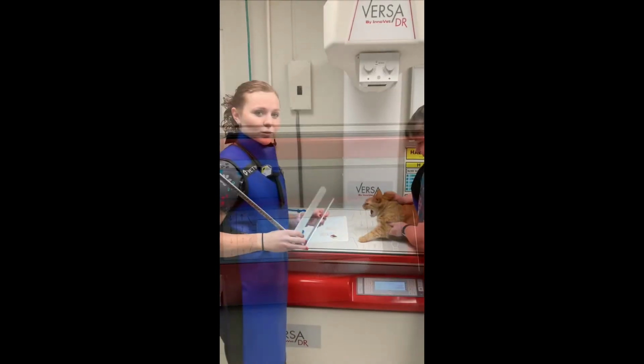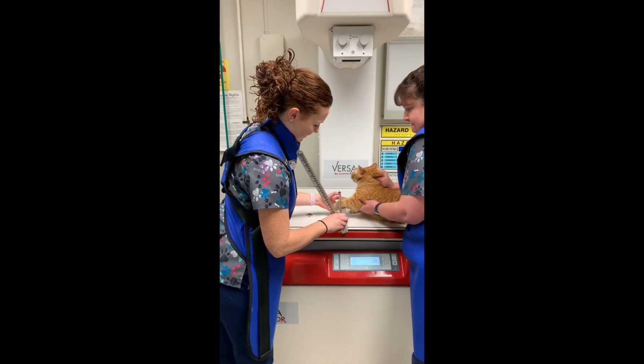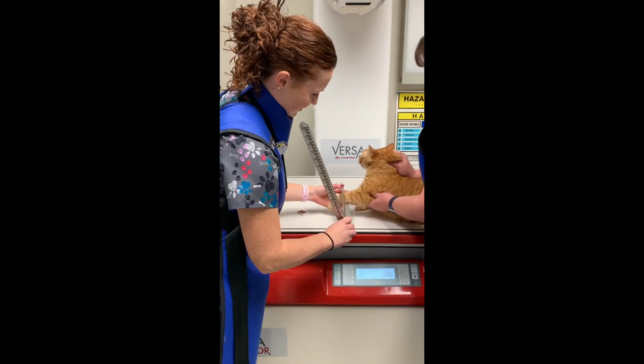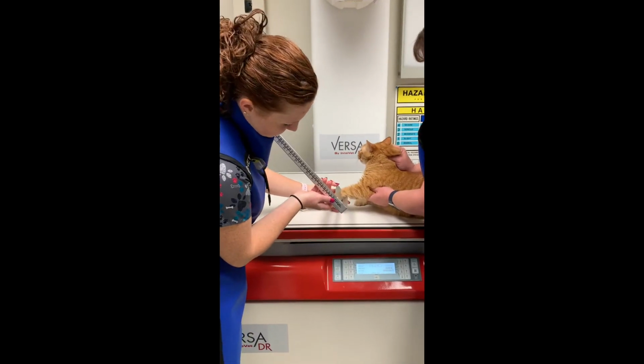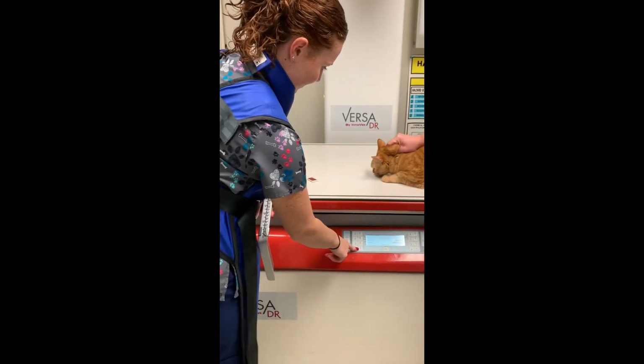So now we're set up, and then I just have to adjust my centimeters once I measure in. So we'll then measure. So we're right at the 3, so I'll turn it down.